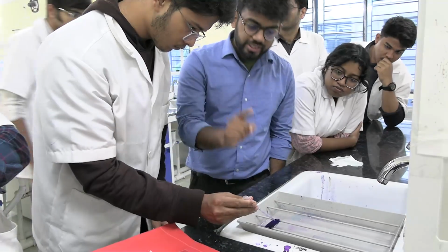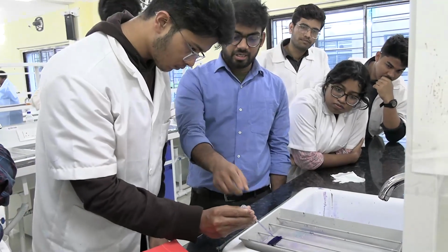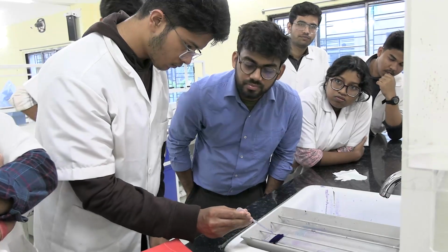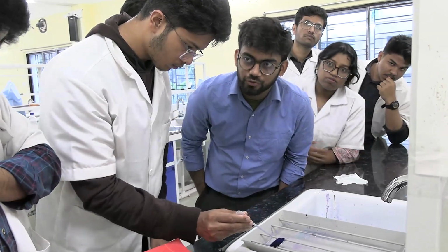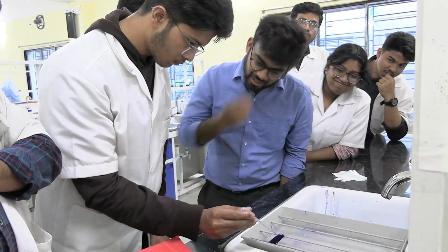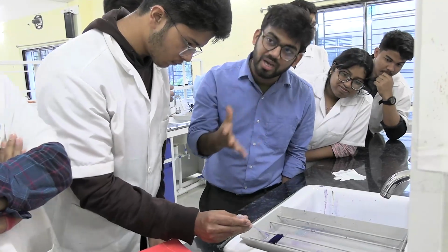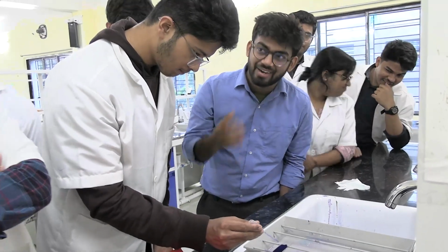For air blowing, there shouldn't be anything in this dropper. Sometimes we use a straw to blow air. What will you do with the straw, blow into it? No, don't use your mouth. I am telling you, don't use your mouth here.